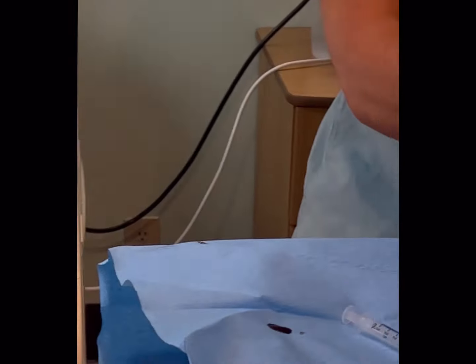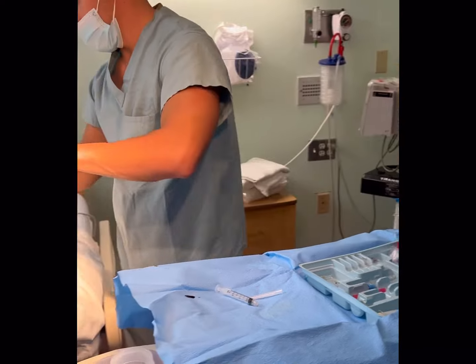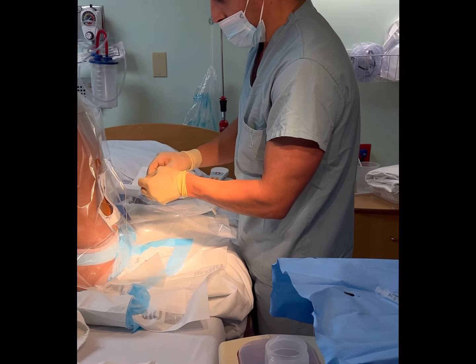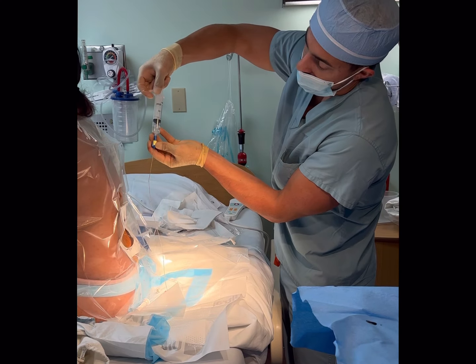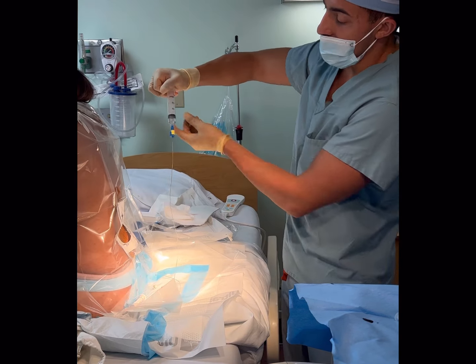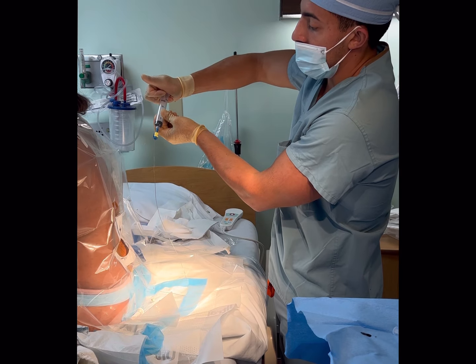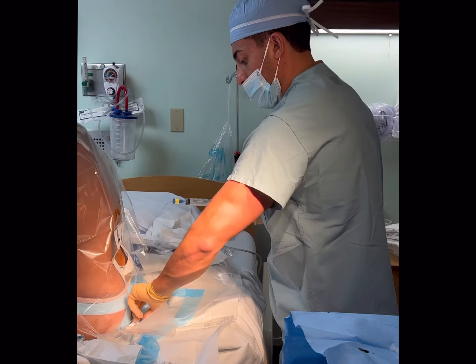I'll connect it and then put some lidocaine in to make sure we're not spinal, then do some epi once we finish up here to make sure we're not vascular. As I aspirate — negative aspiration. Ready for test dose? I'm going to give the leftover lidocaine and some saline just to get her started. It was a good loss of resistance — I didn't see CSF, I did not see blood. It should be a negative test dose, but we're going to test anyway. She's starting at 127 heart rate.